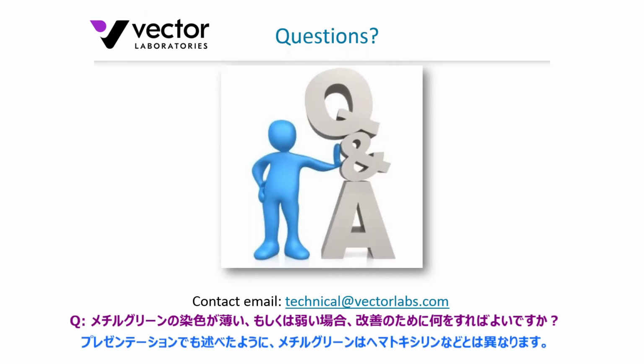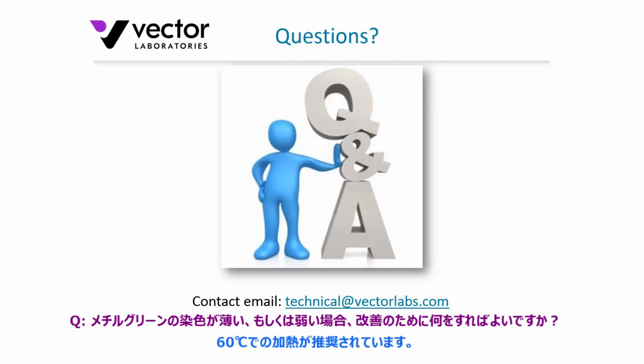Yeah, methyl green, as I did mention briefly in the presentation, it is certainly different from something like hematoxylin. It does require heating, usually to say 60 degrees is the recommended temperature range. And one of the issues I did mention is about investigators who may have a heating block handy, and they actually put the glass slide down on the heating block that's set to 60 degrees and then apply the counterstain right on top of that. And that unfortunately does not generate a sufficient uptake of the stain.